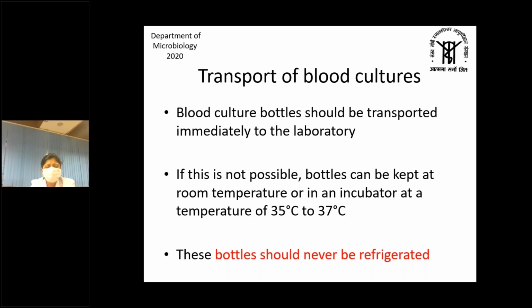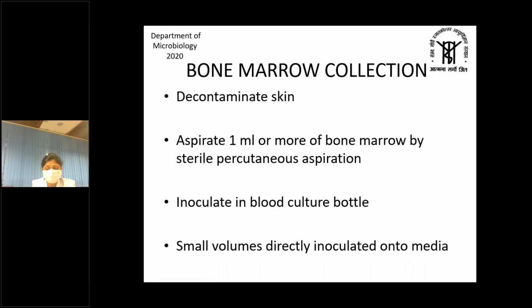Now, as I have mentioned before, coming to the transport of blood cultures without any delay, these bottles should never be refrigerated, preferably kept at room temperature or in an incubator. In fact, these bottles have a shelf life written on them. Even when you are not collecting, these can be left at room temperature. The best part about these culture bottles is that you need not refrigerate them.